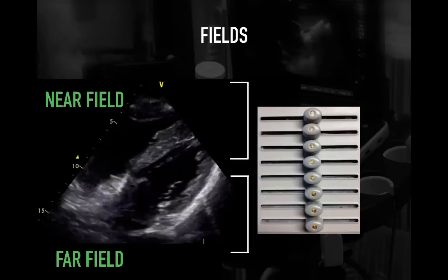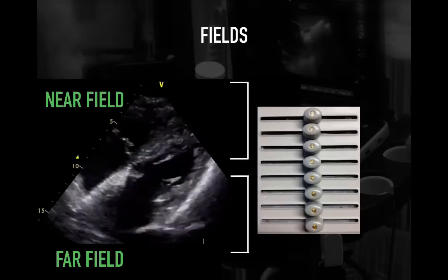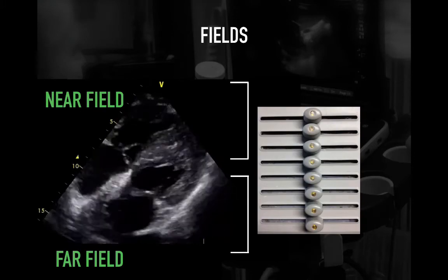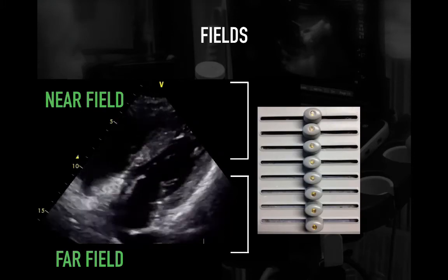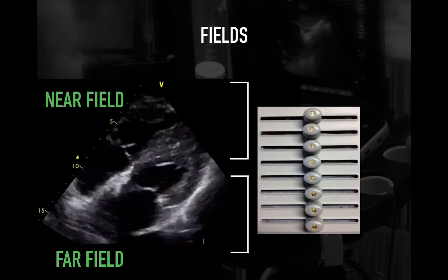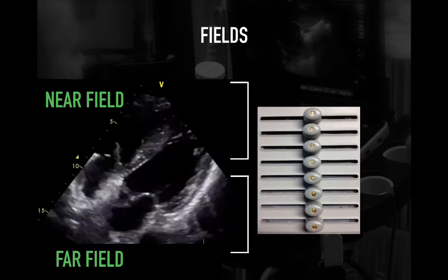Also, again, with reference to near field and far field, some machines will have these slider buttons which can adjust the gain depending on the level. I would most often defer to auto gain, or occasionally a global slider gain button, which I would use as a simpler technique.